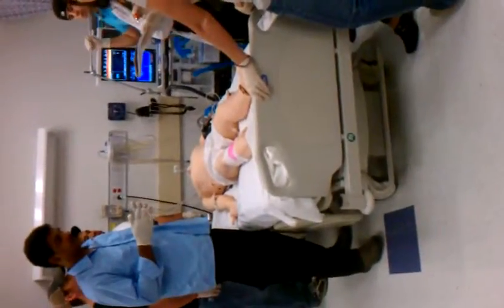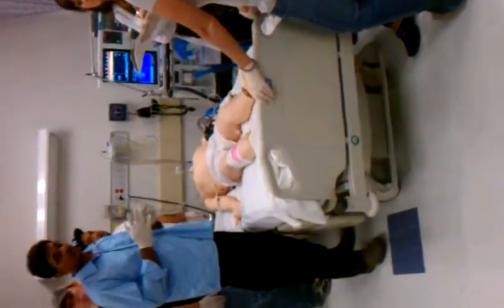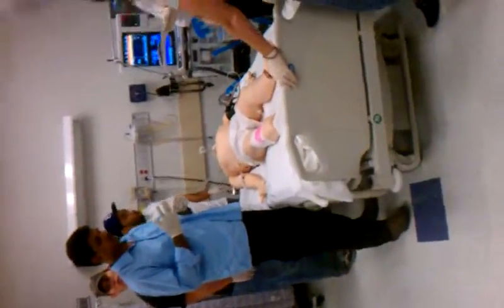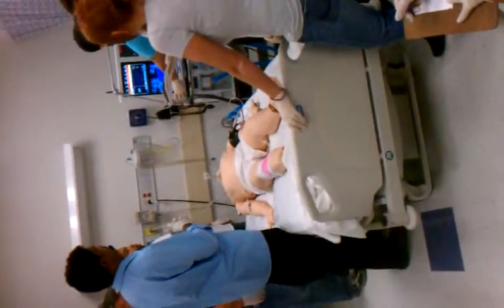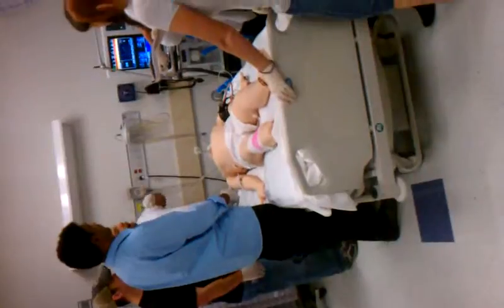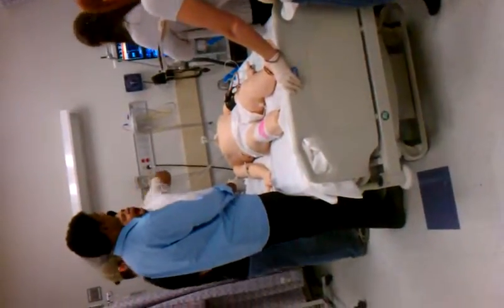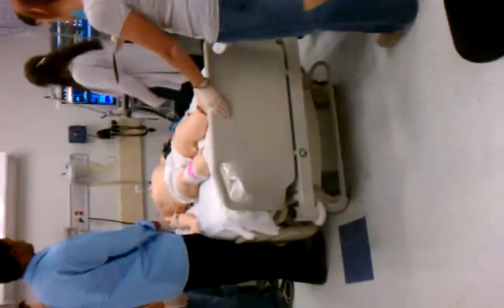What else? Think of it like, what do you want to know? You want to know his vent settings. Okay, so now he's on pressure support ventilation of 6 with an FiO2 of 35% and a CPAP of 5. That's what he's on. I mean, that's just the way they wrote it in this, but that's what he's on: CPAP of 5 with pressure support of 6 and an FiO2 of 35%.